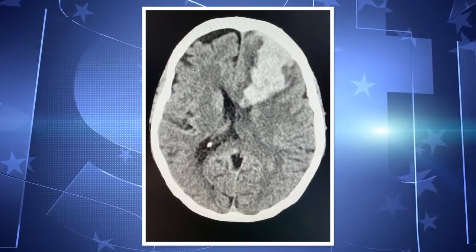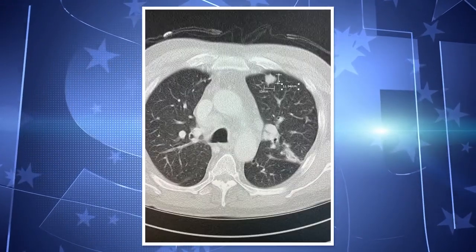Plus, MRI, some of these other scans that we do, if you have metal, some of these things you can have contraindication. CT for almost everyone, there's no reason why you can't get it. Nice. So the ability to scan almost anyone on almost any body part, it's sort of the best all around scan.